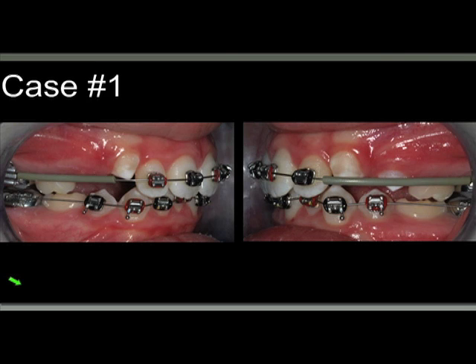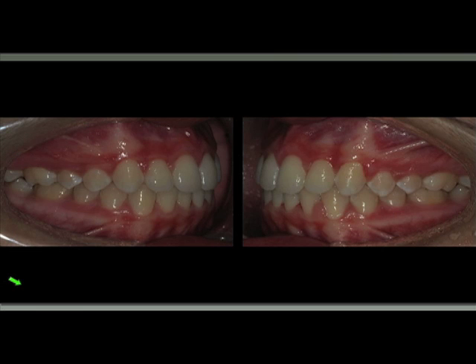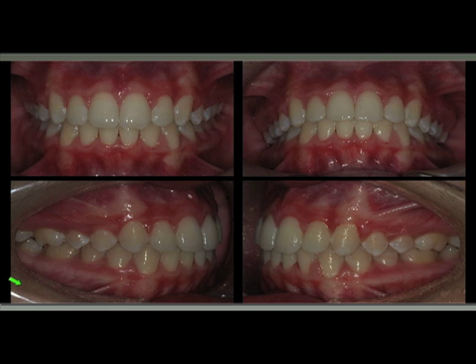Case number one is a class one crowding, and you can see the first wire when we start treatment. This is the last wire just before we remove the appliances, and a very important concept is finishing the case with the appliances in place. You can see here the case after removing the braces. You can see that over here too in this view.